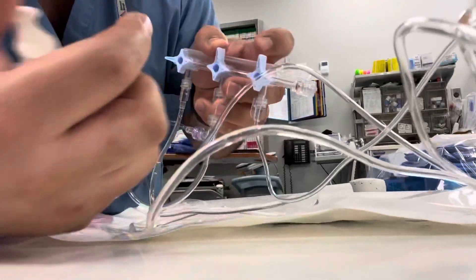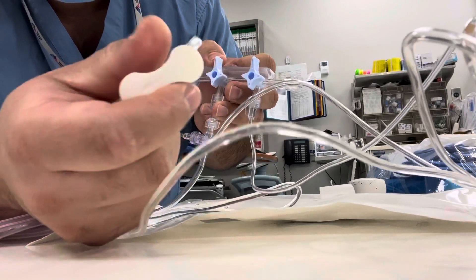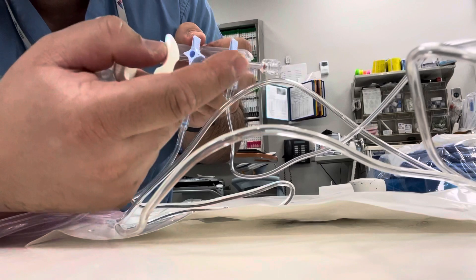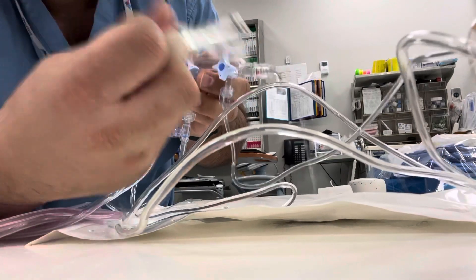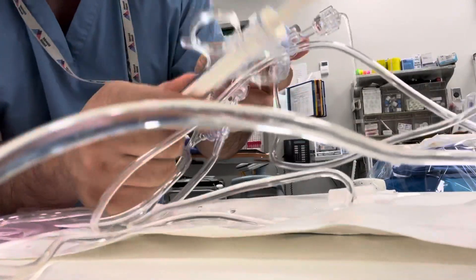Then you ask your assistant to pull the blue string on the transducer — that will allow you to flush this, so you have to get the air out of here. You tap it right here.